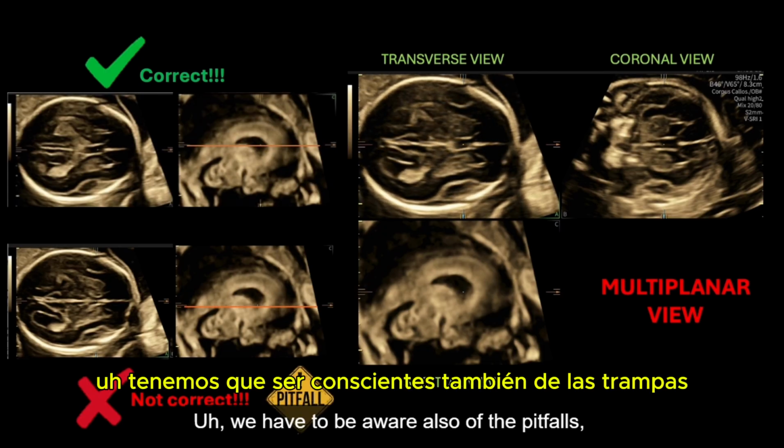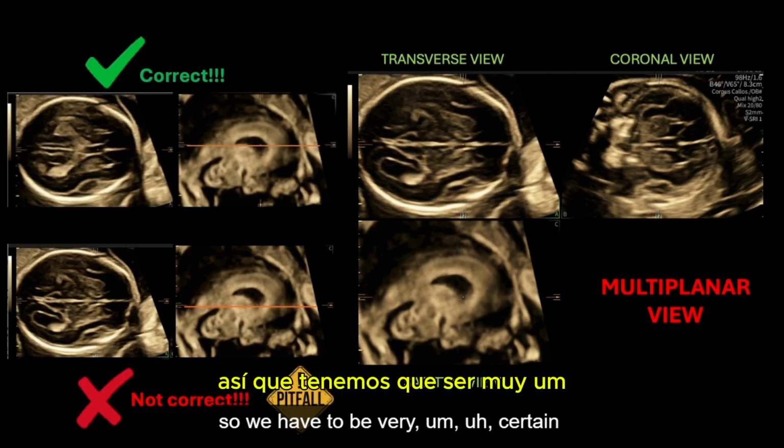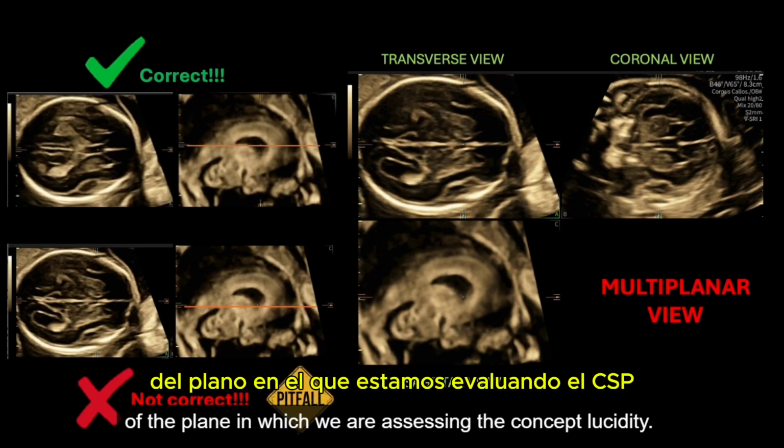We have to be aware also of the pitfalls, so we have to be very certain of the plane in which we are assessing the cavum septum pellucidi.